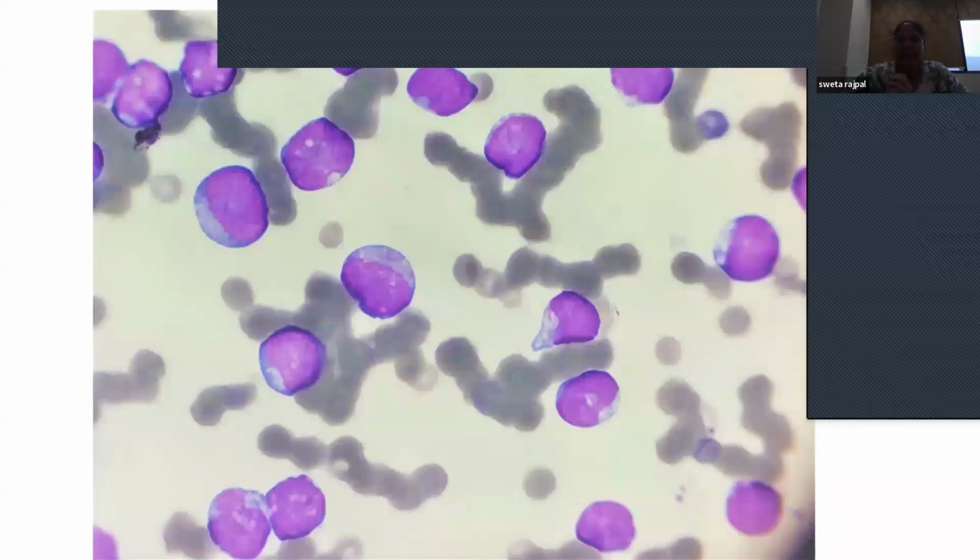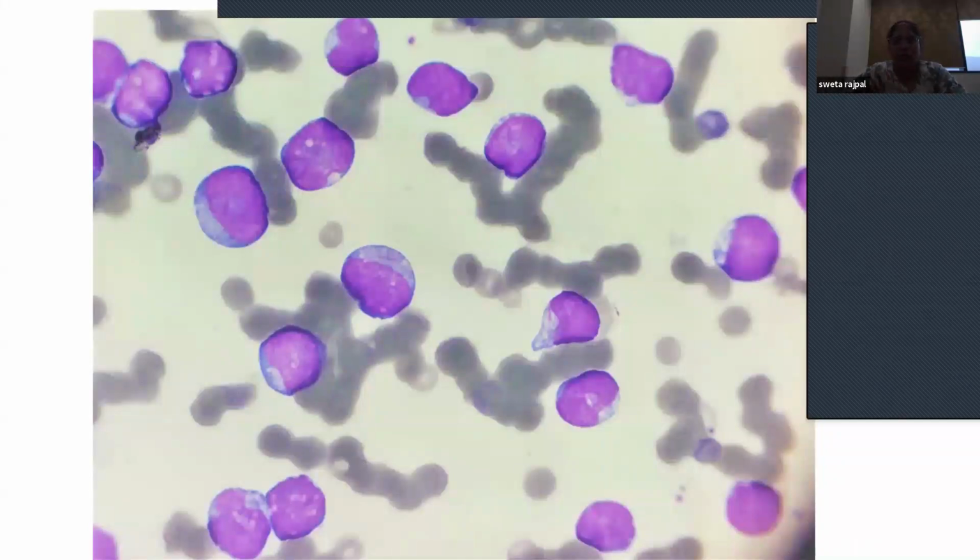And someone has asked, how can we differentiate between peripheral blood and bone marrow? So basically, when you look at the smear, bone marrow will have evidence of bone marrow cellularity. Initially, when I showed you peripheral blood smears, we could see RBCs and neutrophil, lymphocyte, monocyte, eosinophil, but that was normal. Suppose this case had many blasts in the peripheral blood also. How do we differentiate if the smear is from peripheral blood or bone marrow? Bone marrow aspirate most of the time has particles.